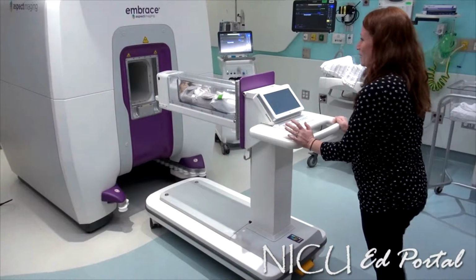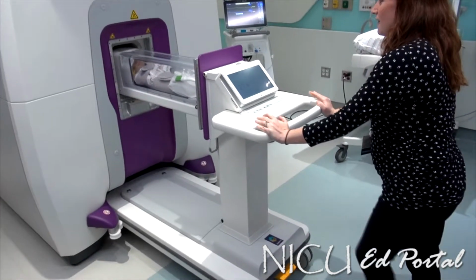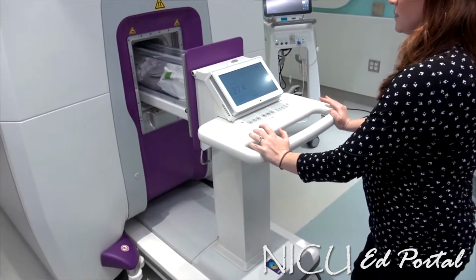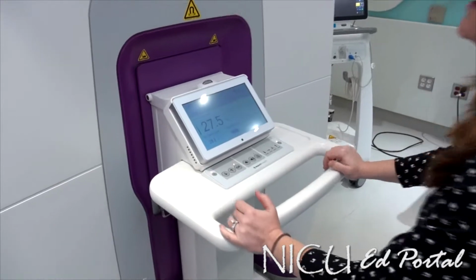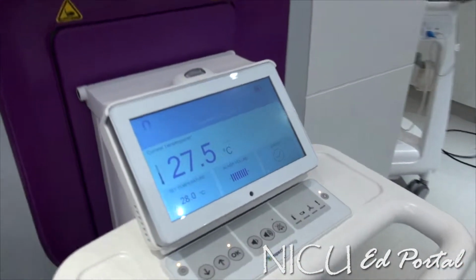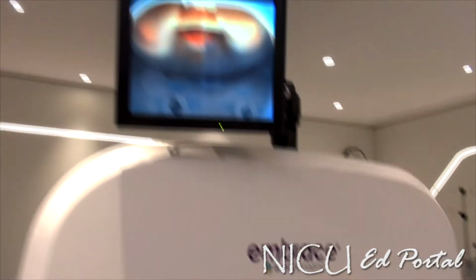So these look great, ready to put the baby into the magnet, and we're going to slowly advance the baby in. And once the baby gets to position, you're going to notice the face on the top of the screen. All right, we're docked and ready to go, and we're now going to put the braking system on to get the baby out quickly when needed. You can see the baby's face.